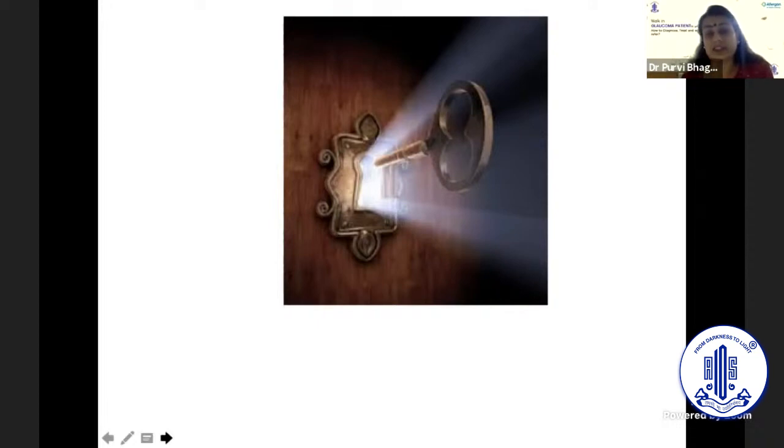Sometimes, as we just discussed, your patients are not responding to conventional treatment. Again, a slit lamp evaluation will perhaps help you to modify the treatment or find out something which has just developed or which we had perhaps missed earlier. And sometimes in complicated cases, the moment you see them on the slit lamp, you find out that this is beyond my purview and my capabilities and skills. So you know that you should immediately refer the patient to a specialist or to a higher center.